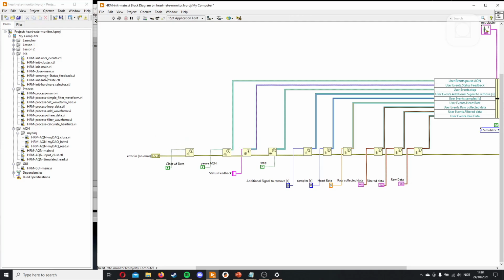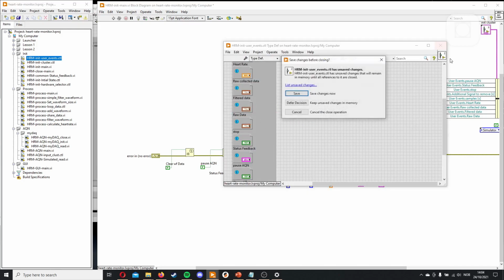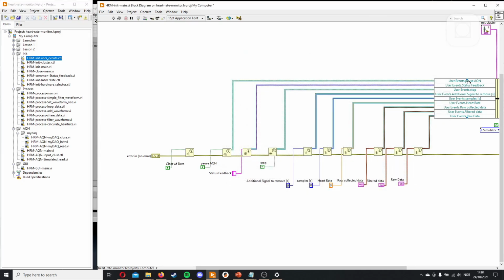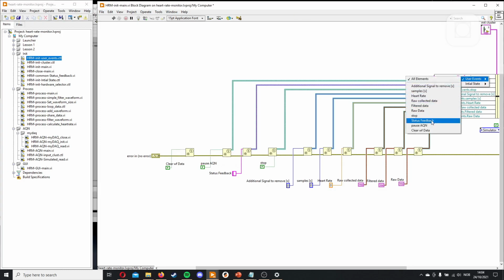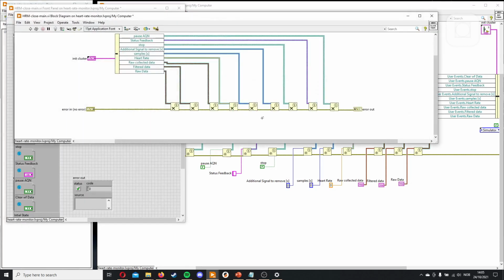And let's add this to the cluster, the user event cluster. And now insert it into the event so that the initialized user event is stored. And we'll go to close it immediately, or else it's very easy to forget.